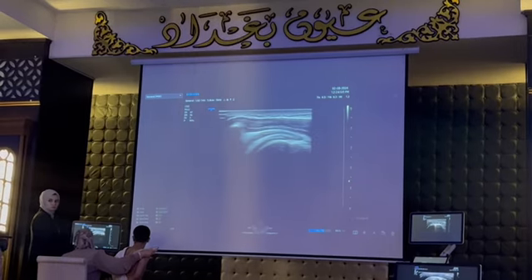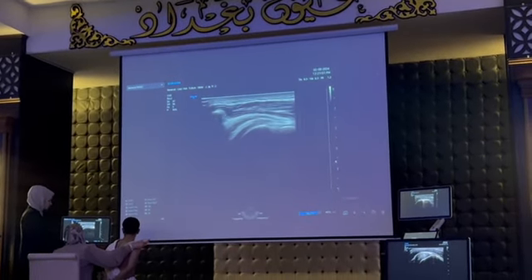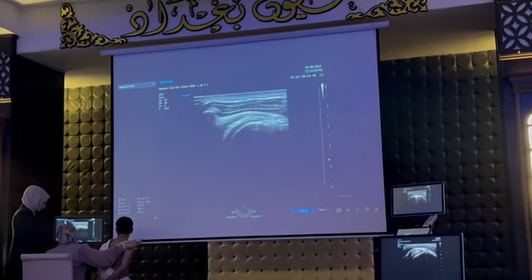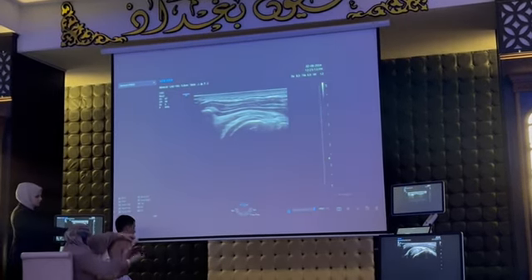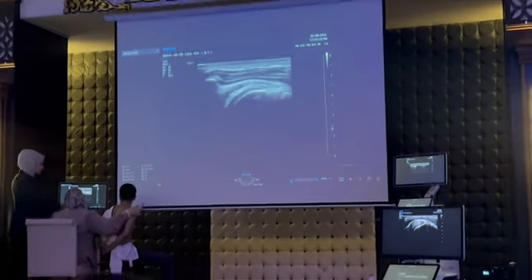Between the deltoid and this muscle is the subacromion subdeltoid bursa. So when there is bursitis, you can do an injection here by entering the probe in an in-plane technique. Like this or like this. With a 22 gauge needle, 10 centimeter length.